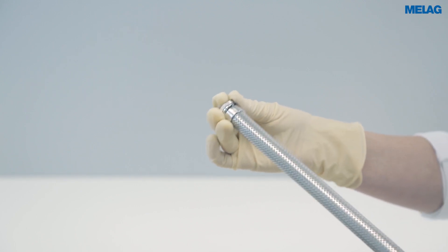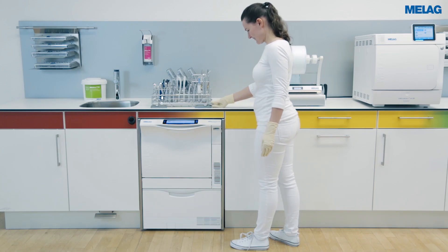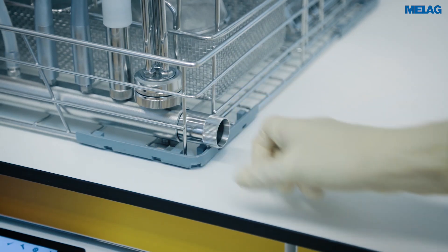Close the sealing cap and then reinsert the Cleanfinity filter in the injector rail of the basis basket.